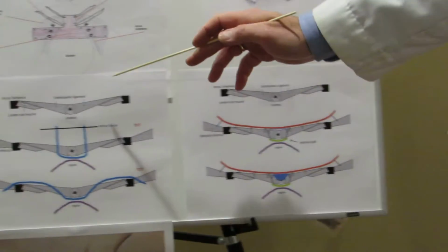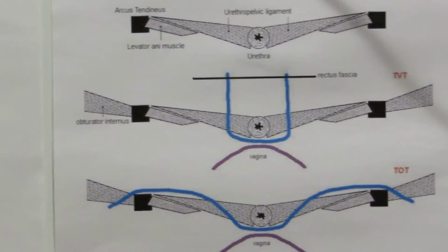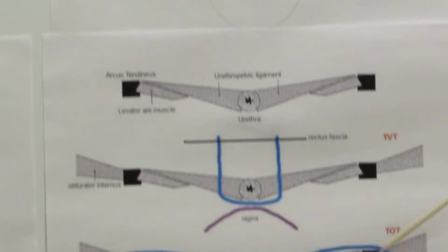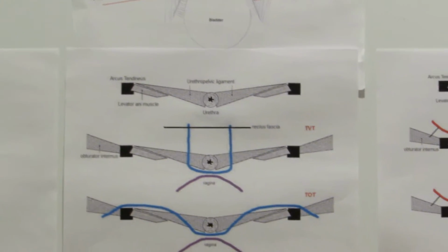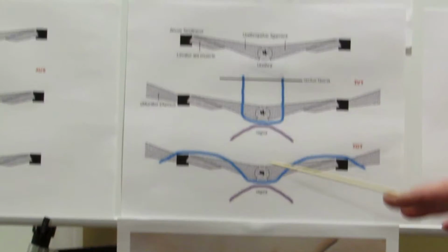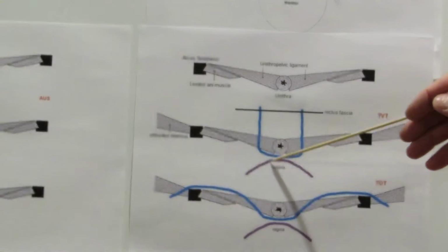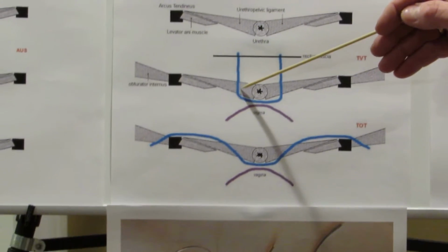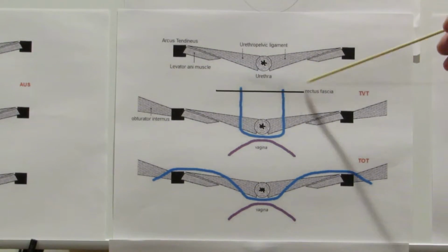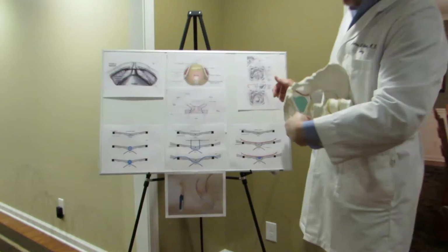Now here in this picture is the popular mid-urethral sling that was done over the last 15 years, probably about 90% of the time, for stress incontinence. These are done with trocar devices hooked to a sling material. This is the standard anatomy. You go through the vagina with some scissors, you isolate this area, open it, go underneath the urethra, and perforate fascia this way. So you perforate this urethropelvic ligament and also this rectus fascia, and you would pull up.